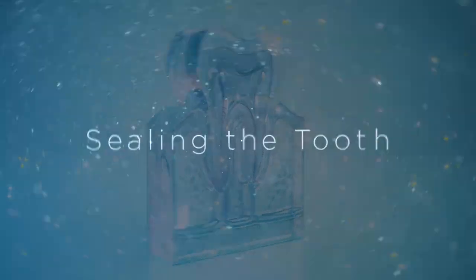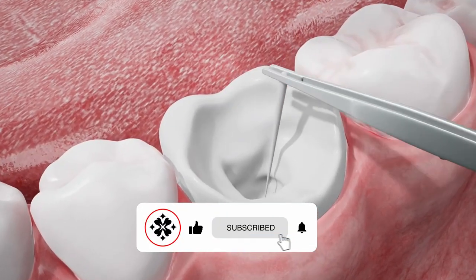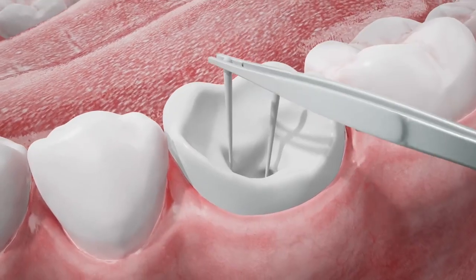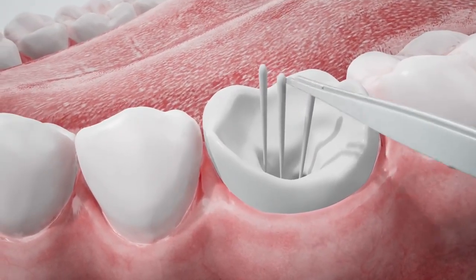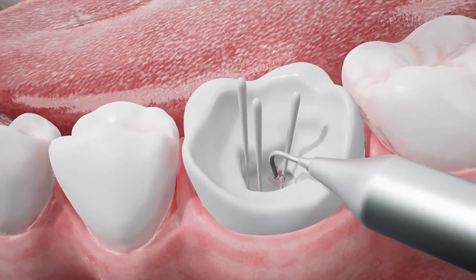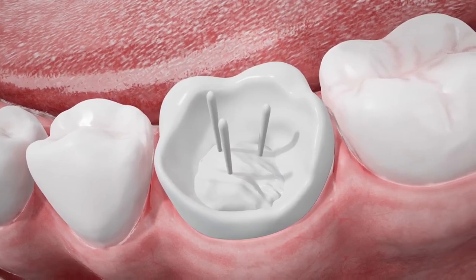Sealing the tooth. After the canals are thoroughly cleaned and shaped, the next step is to fill and seal the tooth. The dentist will fill the cleaned root canal with a biocompatible material called gutta percha, which helps prevent future infections and reinforces the tooth structure. Once the canals are filled, the dentist will seal the opening with a temporary or permanent filling. This step is important for protecting the tooth and preventing bacteria from re-entering the area.